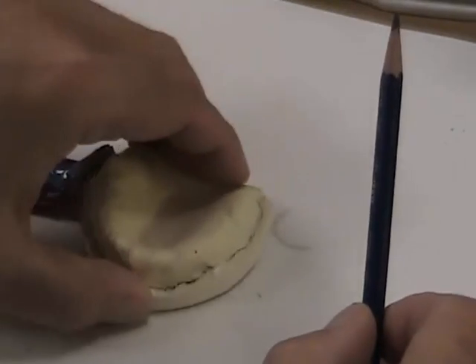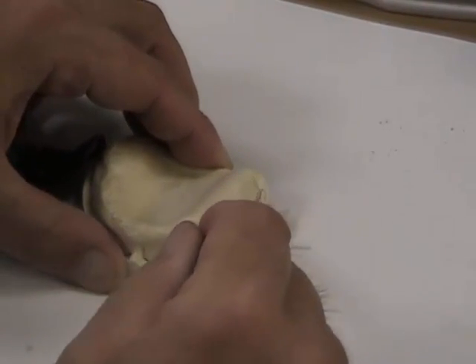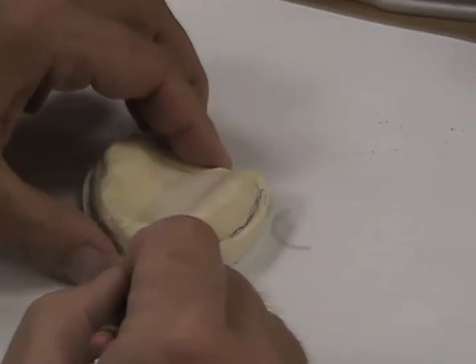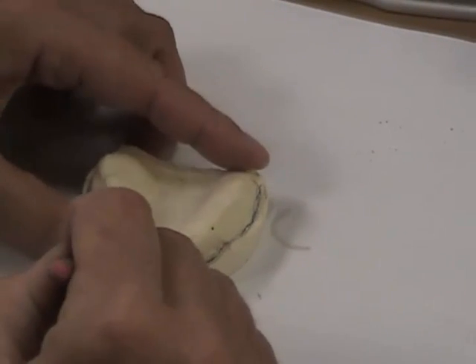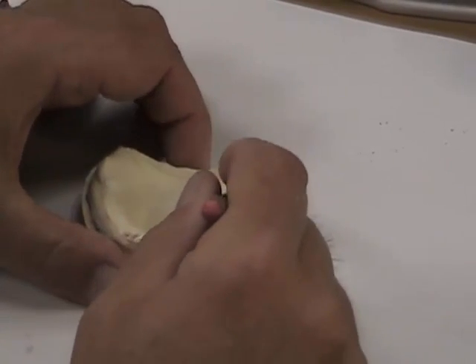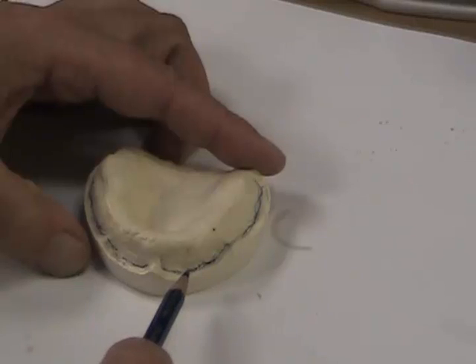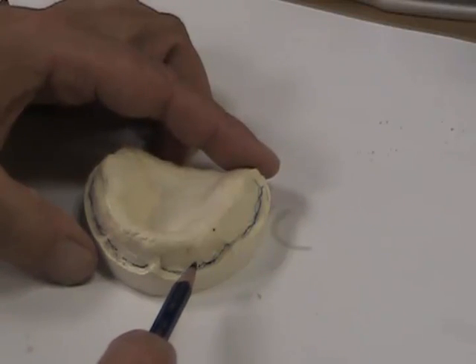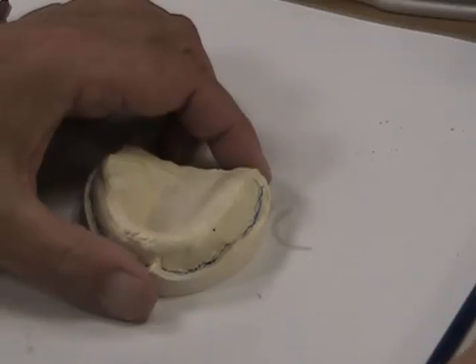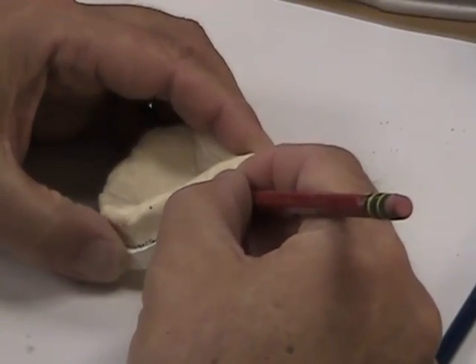The bottom of the vestibule — I'll use this blue pencil to illustrate — that's the bottom of the vestibular area. That area is the area that we want to border mold. In order to do that, we have to make custom trays, which are short of that by about an eighth of an inch. I'll illustrate with a red pencil.